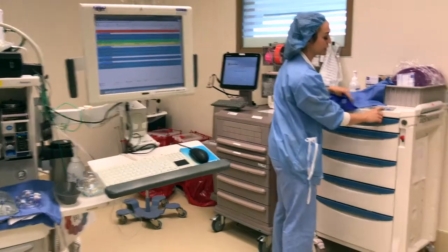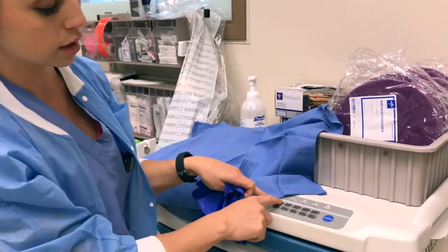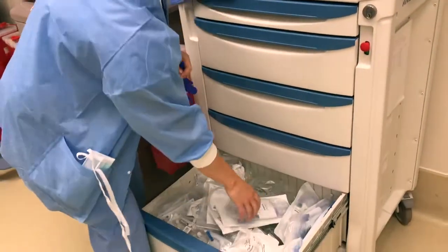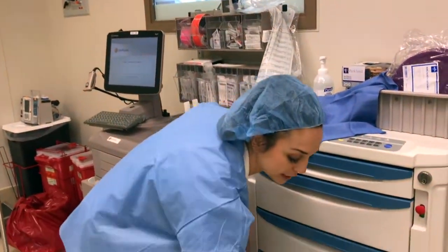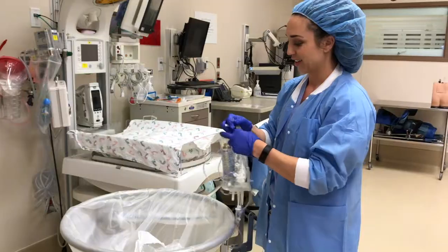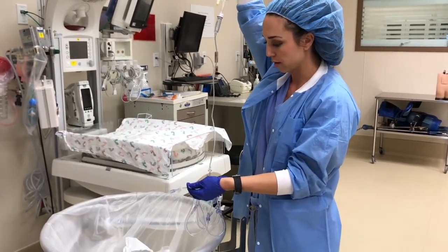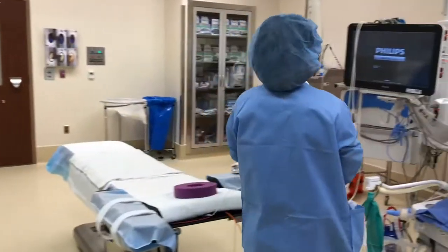You're going to come over here to your cart. All the carts are 0, 9, 1, 1 to unlock. The second part of your IV fluid, your line, is going to be down here at the bottom. I've opened a couple over there, so I'm going to use that. This is also where your blood pressure cuffs are if you need to use that. And so you want to prime your line, make sure that you get all the bubbles out. Clamp it off. And then I go ahead and hang my bag over here.